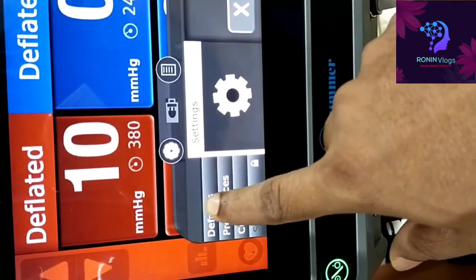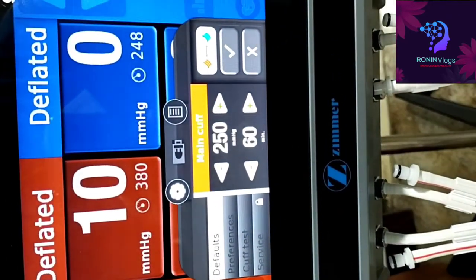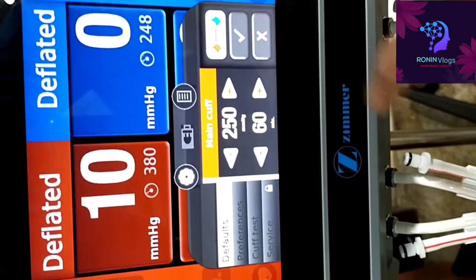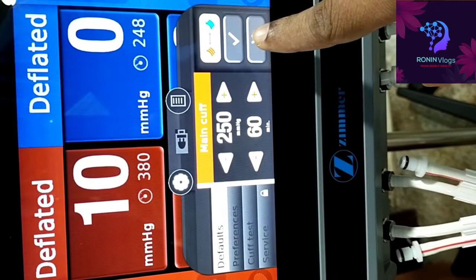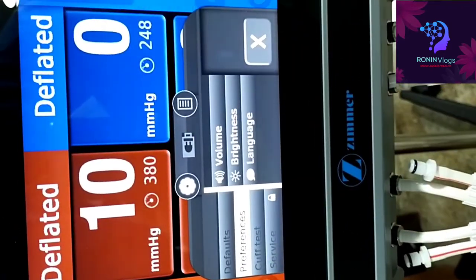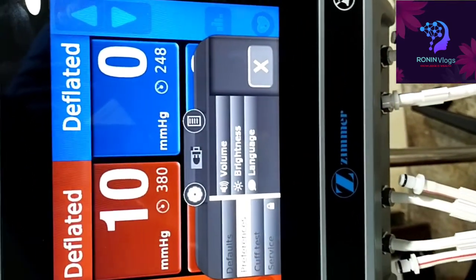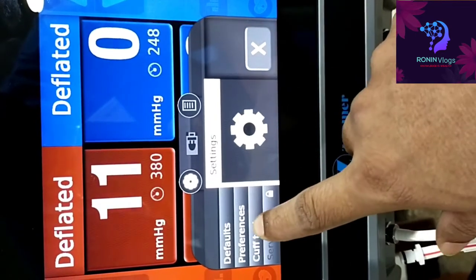This is the settings - defaults, preference, cuff test like that. Before using, we need to do the cuff test, then only if any leakage we can find out. The cuff test and settings, everything available here in this option.